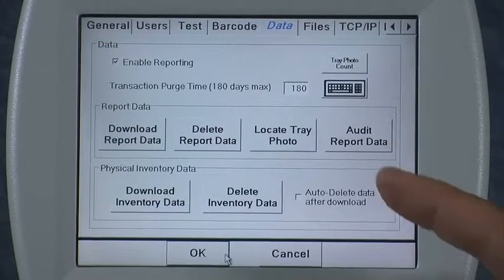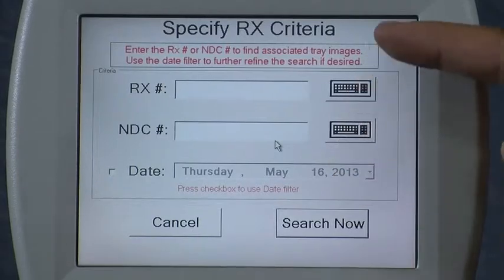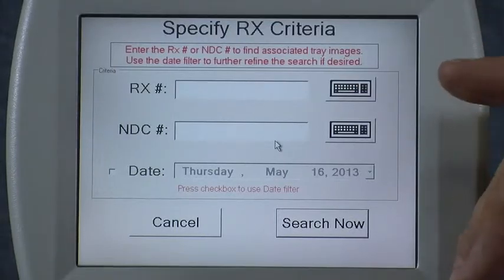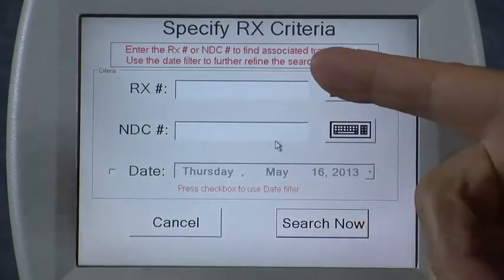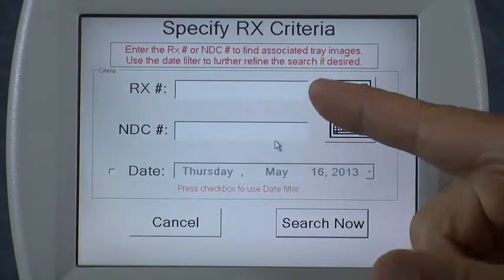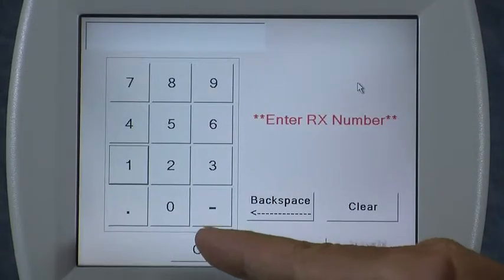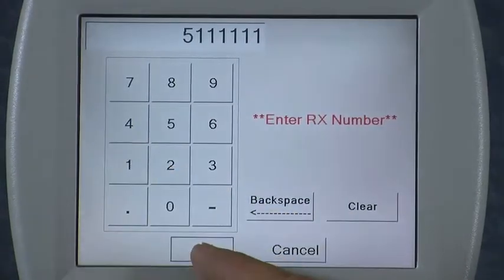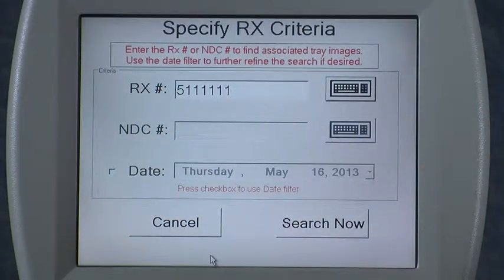Next I'd like to demonstrate the locate tray photo feature. Press the locate tray photo button and the icon allows you to choose various criteria to determine which tray photo you want to locate. If you're using the icon in validation mode or the new count-only mode, the icon knows the prescription number and that's typically what you'd want to choose. Click the keyboard icon next to the RX number box and key in the prescription number you're searching for, then press OK. The icon will left-pad that number with zeros to normalize it to a fixed length so it can find that prescription number.